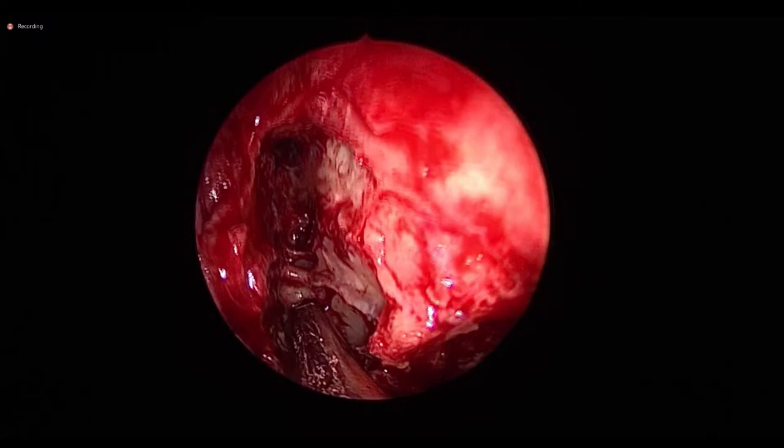Ostium. Now, staying anterior to the sphenoid ostium, finish your posterior ethmoidectomy. See this? Simplest way. Keep the sphenoid ostium in view. In one minute's time, this is now fast endoscopic sinus surgery. Different FESS. See now? Retrograde, flushing the skull base. See this? Another way of doing the same thing. See now? Everything done?